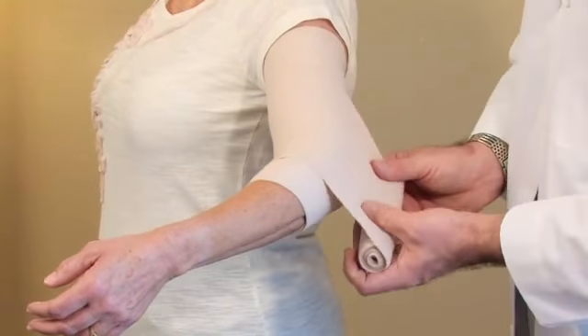Hello, I'm Dr. Robert Fennell with HandAndFootPain.com, and today I'm going to show you how to wrap an elbow with an ACE bandage.